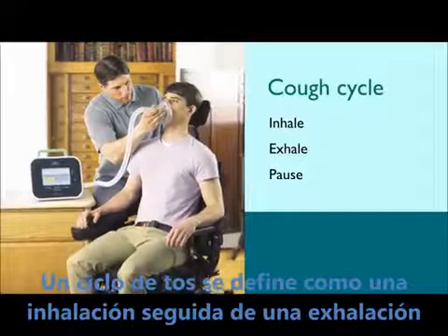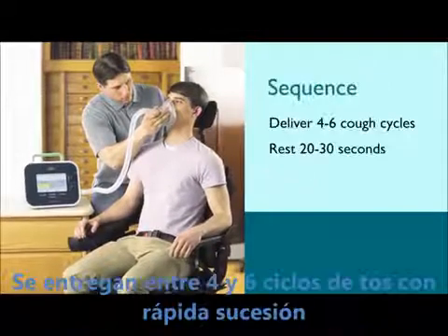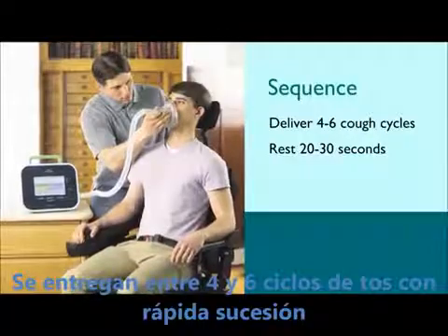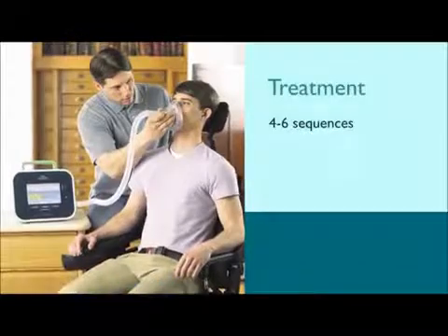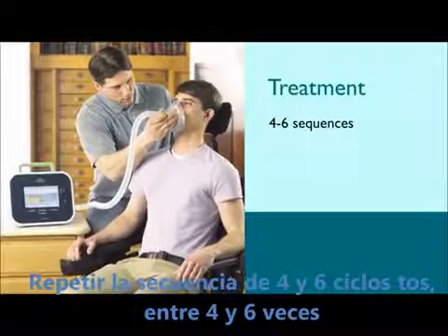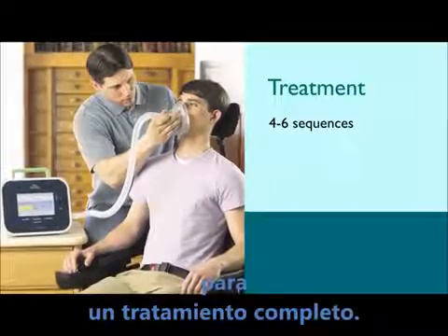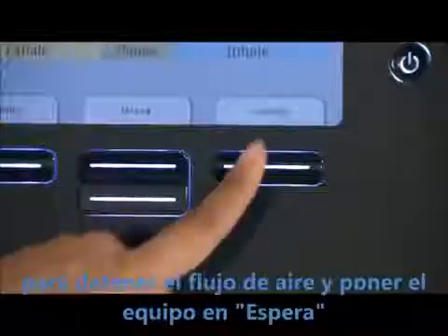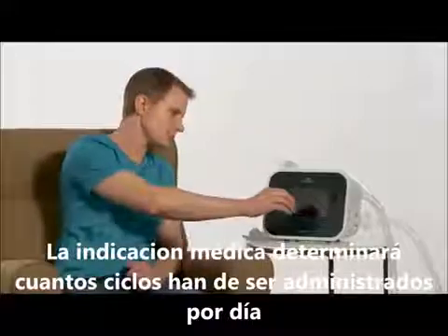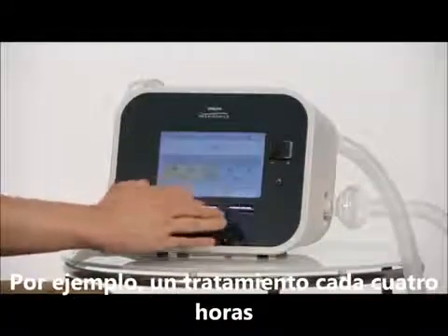A cough cycle is defined as inhale plus exhale plus pause time. Deliver four to six cough cycles in rapid succession followed by a rest period of 20 to 30 seconds. Repeat this sequence — four to six cough cycles and rest period — four to six times for a complete treatment. When the treatment is finished, press the right button to halt the airflow and return to standby. The patient's prescription will determine how many treatments are to be administered each day; for example, a treatment every four hours.